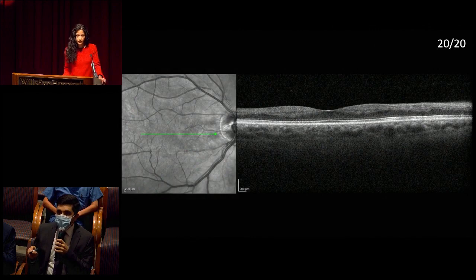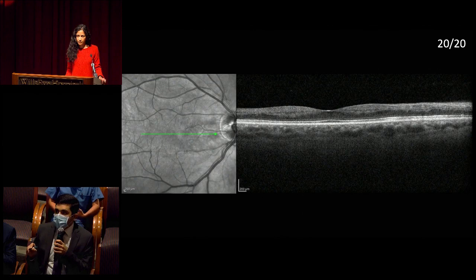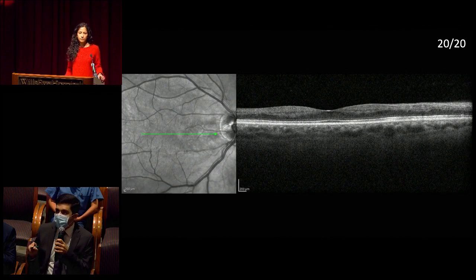We have a horizontal raster OCT of the central macula in the right eye. On the infrared image we appreciate those vascular changes in the inferior arterial region of the macula. On the OCT B-scan, the vitreous is optically clear, the choroid has normal thickness and appearance. The outer retina appears well-preserved, but in the inner retina we see focal areas of inner retinal atrophy — the layers have a collapsed and ill-defined appearance, at least focally.